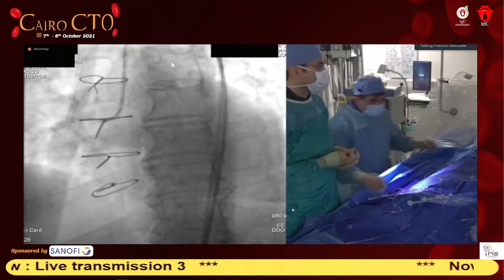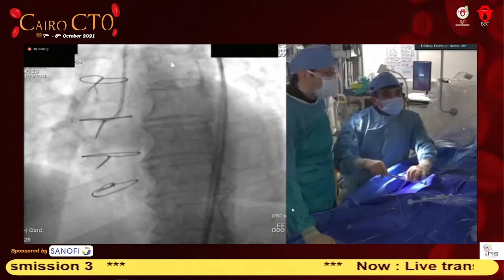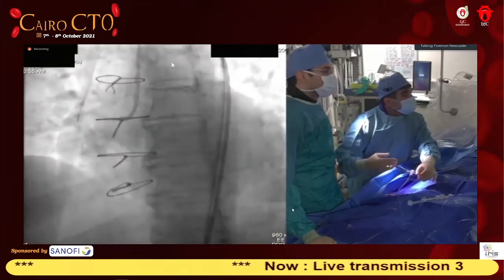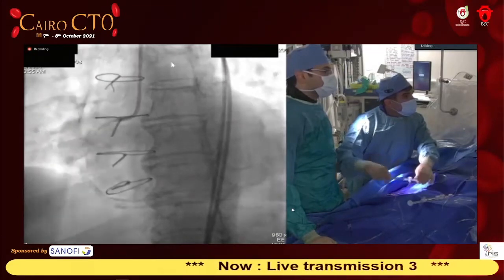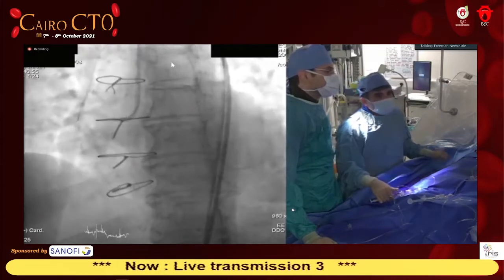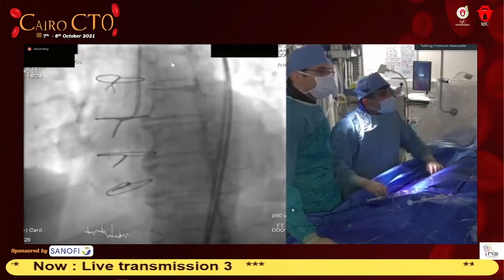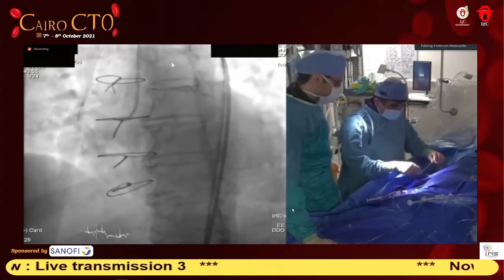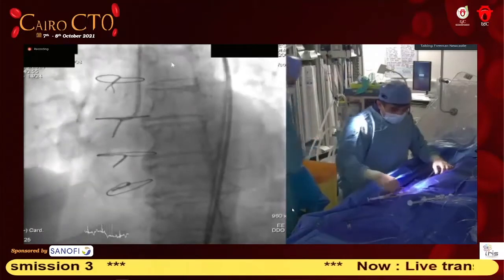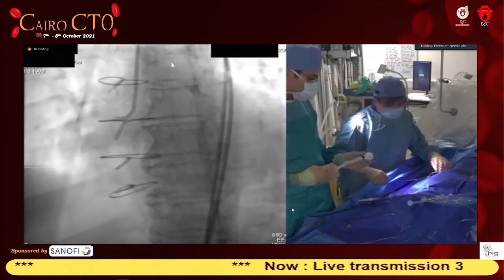What about the hemodynamics? The blood pressure is okay? The blood pressure is about 93. It was a little bit higher before, but okay. Can I have a 3.0 by 20 or 2.5 by 20 non-compliant balloon, please? So now it's a normal angioplasty. Do you prefer to give some nitro or no? We will, once I've dilated. And once I've done that, we will give some nitrate, definitely.